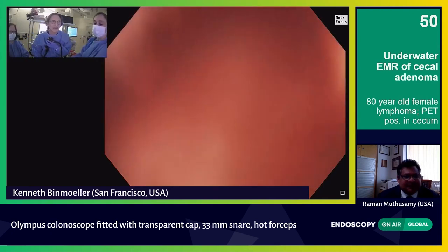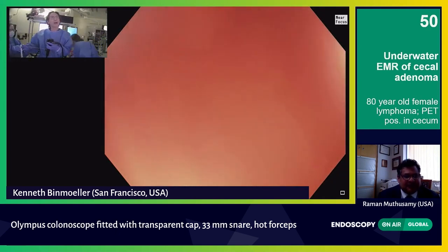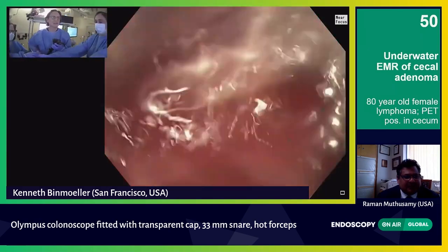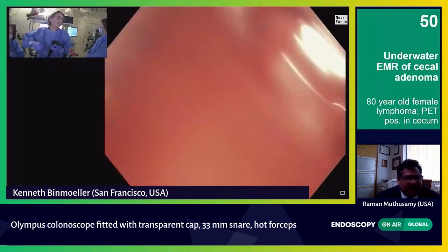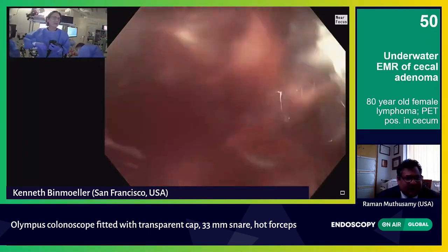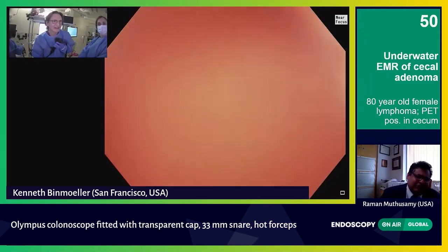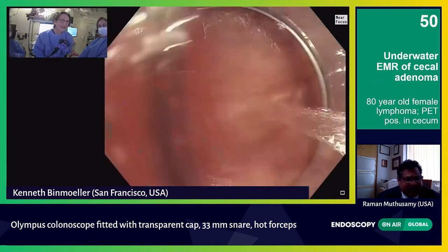If we had that Japanese solution gel, we could see it beautifully, but now it's just going to cloud up. So I'm going to switch to gas now, and with the hot biopsy forceps I'll coagulate that vessel. You'll have a chance to see what this looks like with gas. I have to aspirate out the water and switch to the gas view. I think that was a nice example — you spent a lot of time carefully assessing the lesion and took out really an enormous amount, perhaps even all of it, just in a single specimen.